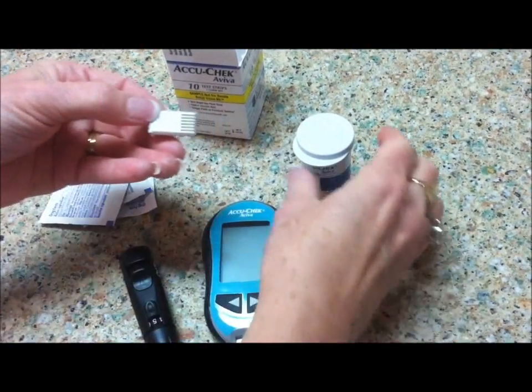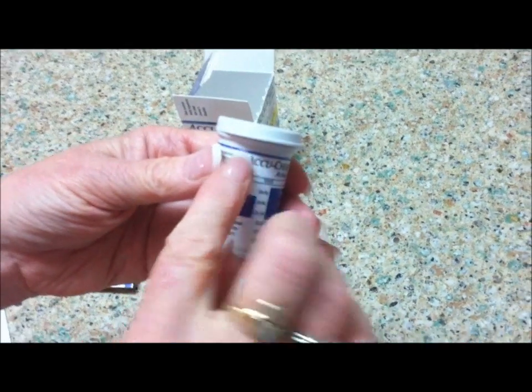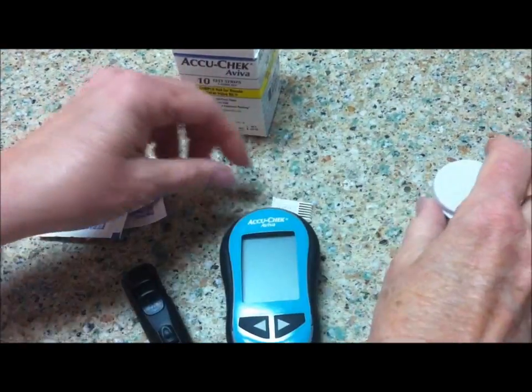The code chip reads 245, and that corresponds with code 245 on the AccuCheck bottle. This way you know that all the strips will give you accurate results, as long as that code chip is in.